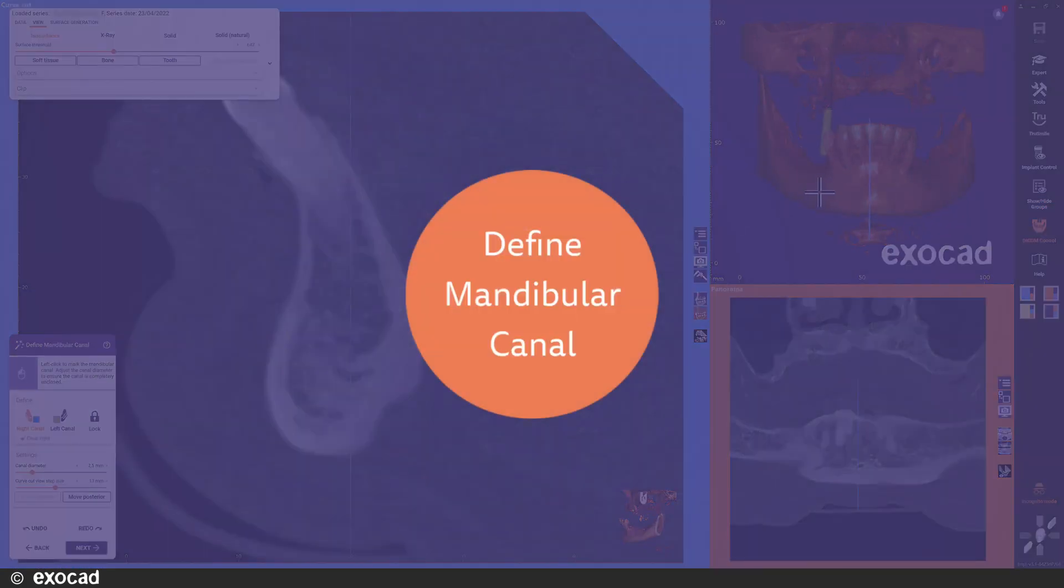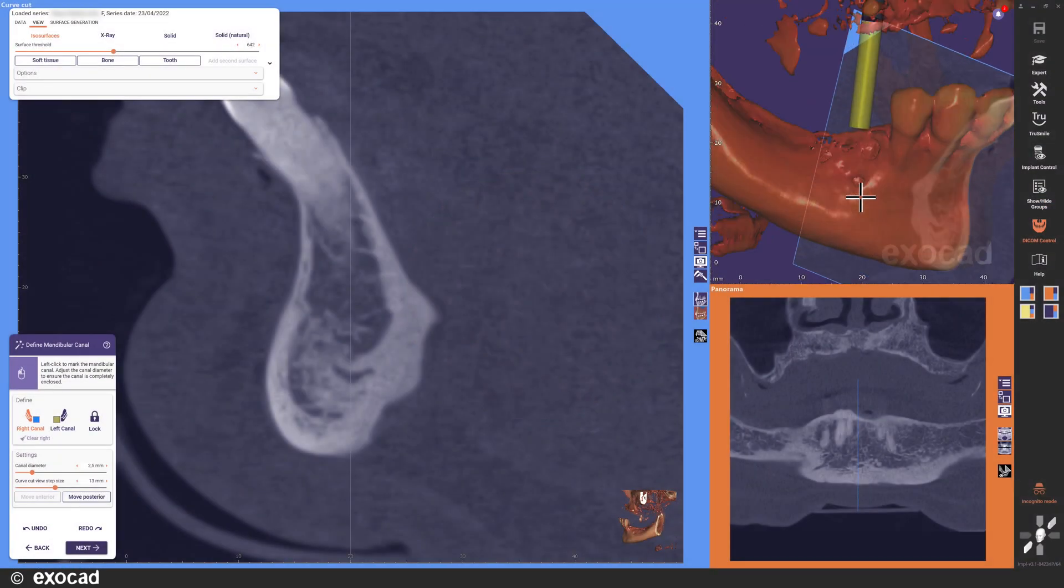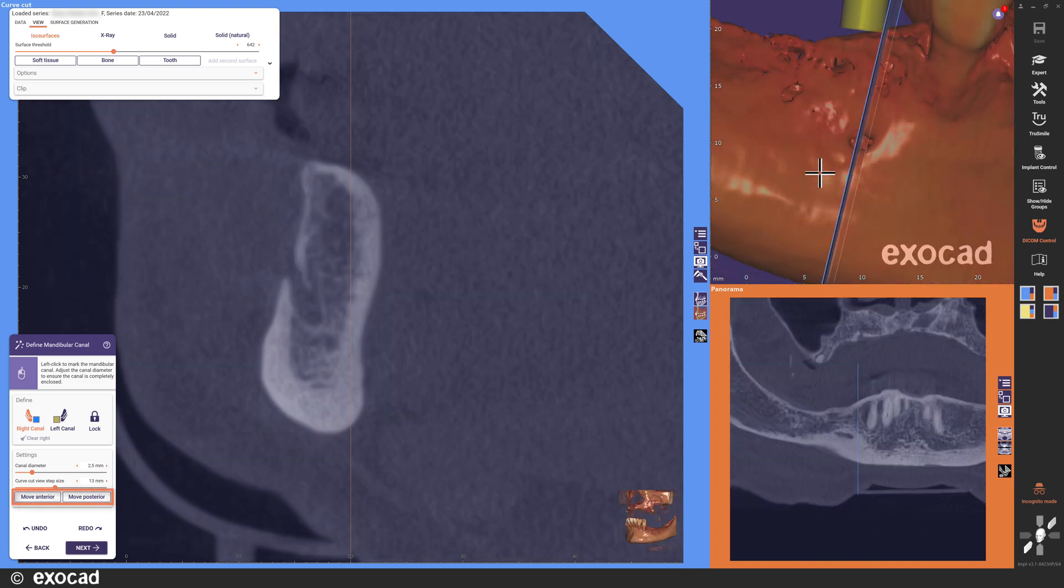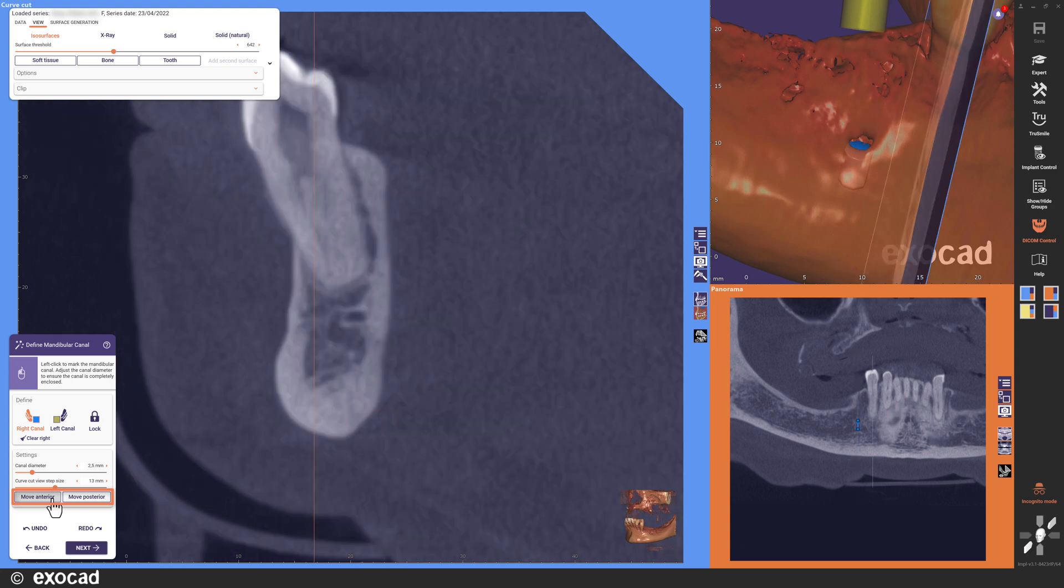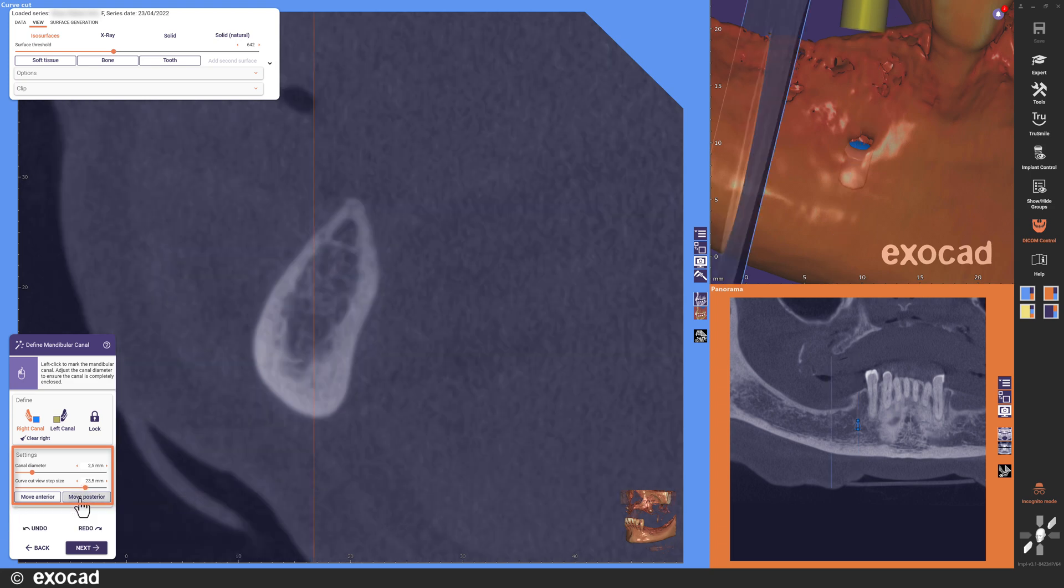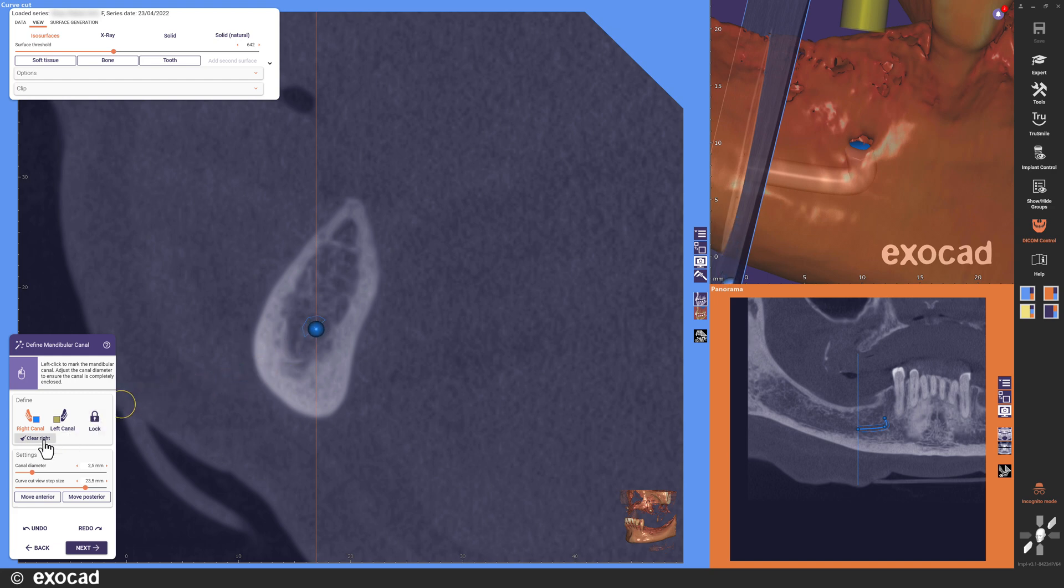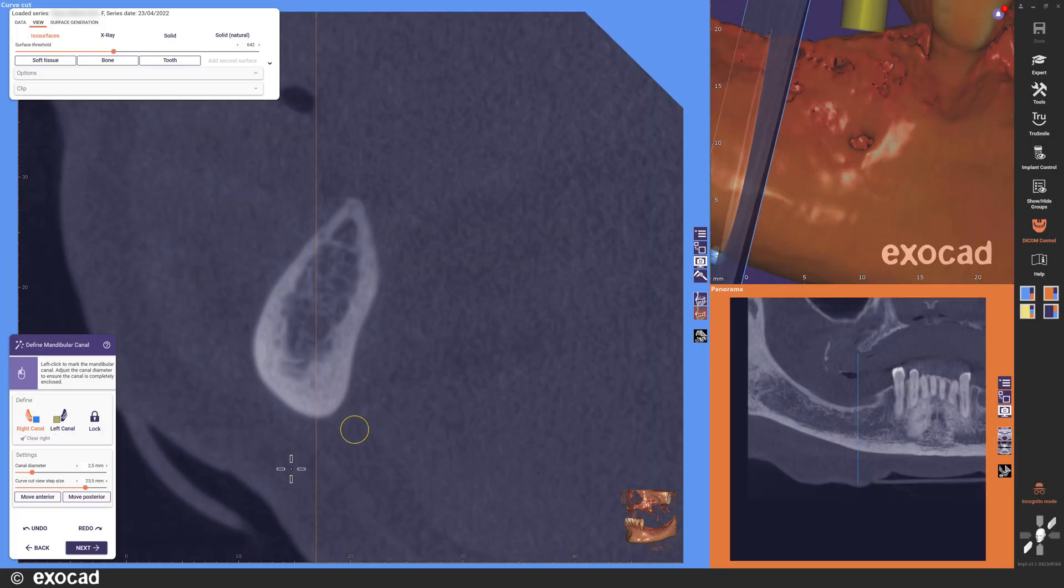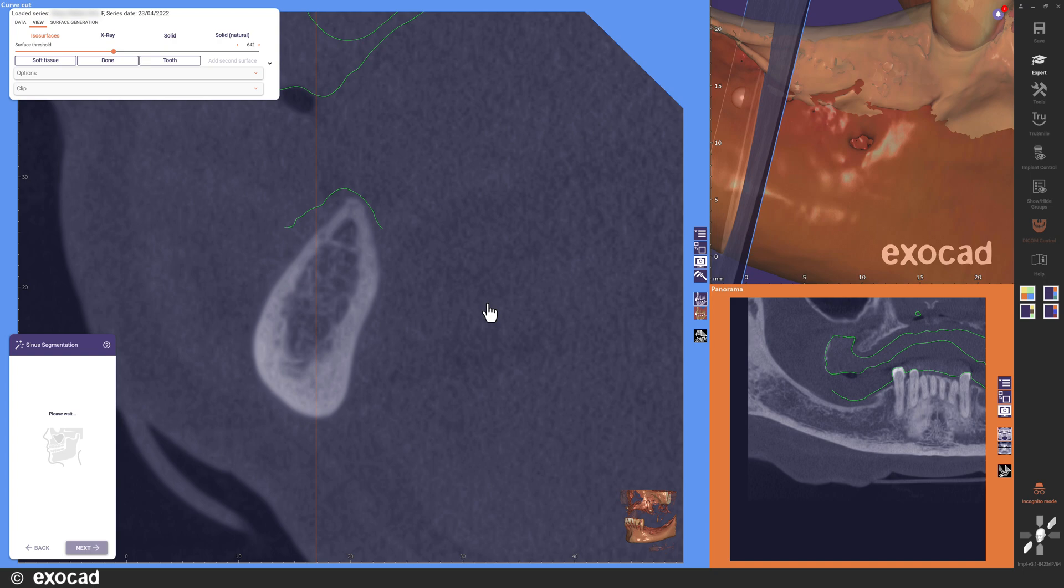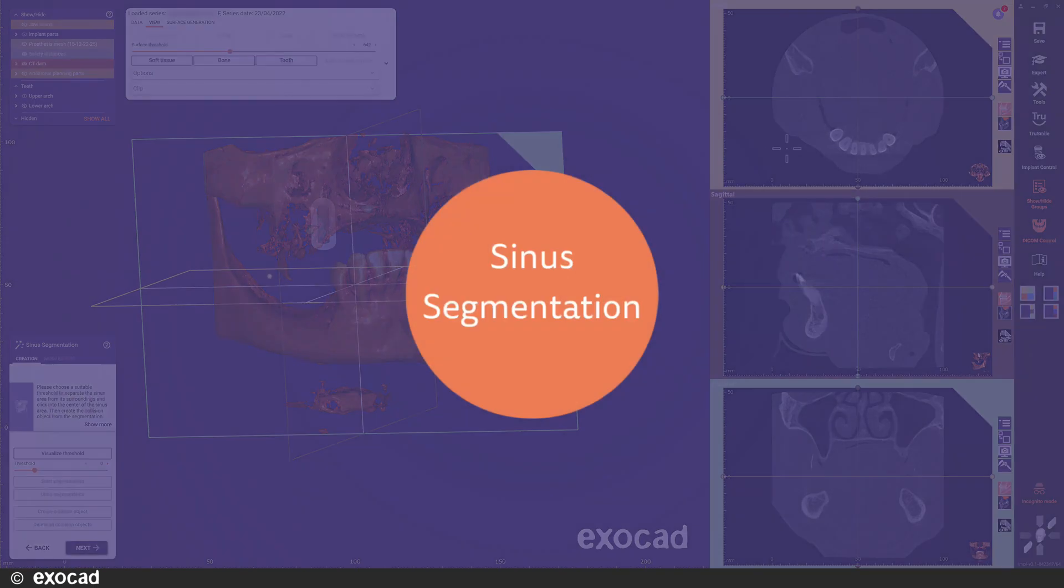Next step is the define mandibular canal step. Two new buttons, move anterior and move posterior, have been added to make it easier to move through the slices of the CBCT data with a curve cut view. Use the slider to set the incremental distance for these buttons. Also new in this step is that you can skip the marking completely if you want. Just click next and select to continue without marking the canal. A note will be added to the report with information that the step was skipped.